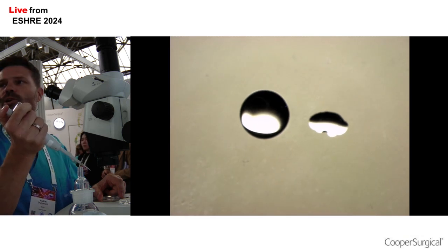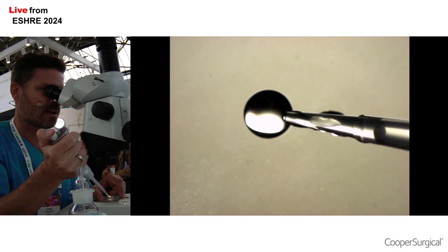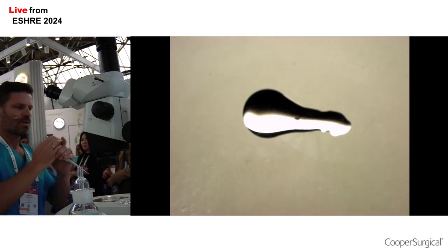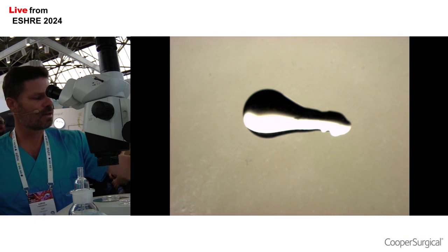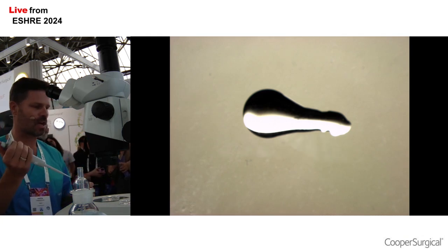And I'm going to use my pipette and join those 2 drops up to create a bridge, like that, okay? So now we have an interface where on the left hand side we have media, and on the right hand side we have SpermSlow, which is the media which contains hyaluronic acid.